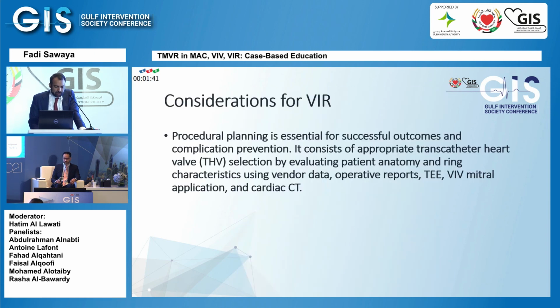It's very important in valve and ring to know which ring you're using, to double check the vendor's data, to do CTs, to use the app, do TEE, get all the imaging possible in order to have a successful case. I'm going to stop here. I'm not going to talk about mitral valve and valve because it's more straightforward.